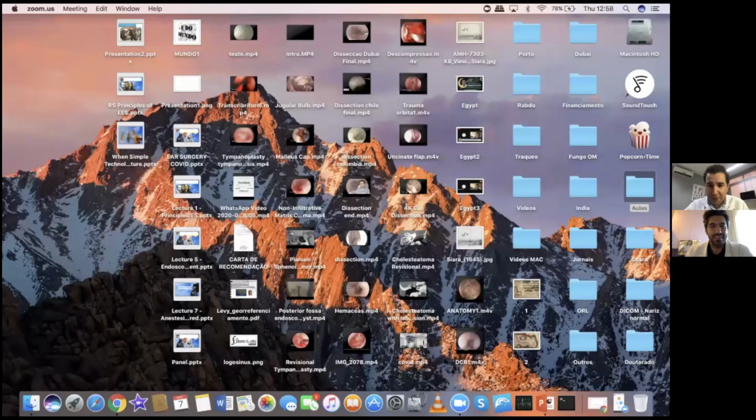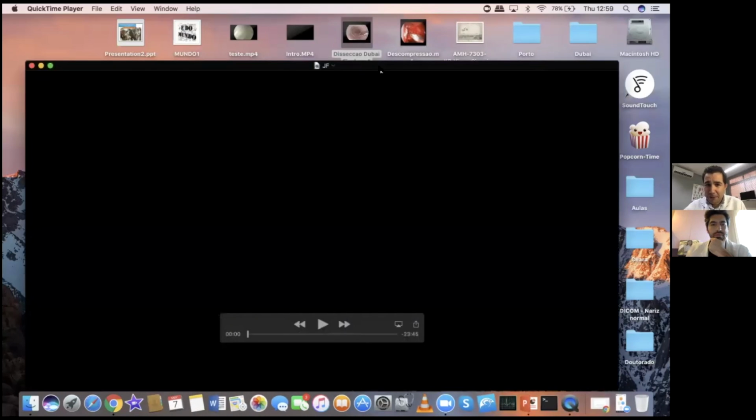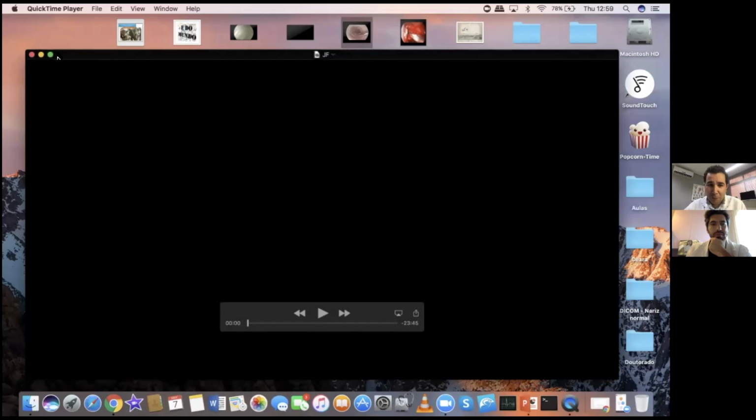I didn't prepare any formal presentation because I think for a dissection, it's better to have videos or movies. So I will show some videos of dissections that I've done in several congresses throughout the world for us to understand the middle ear endoscopic anatomy, which is the same as the microscopic or the macroscopic anatomy, but since you view with a different kind of view, it's a little bit different. So first of all, I would like to show this dissection. I'll put it on full screen.